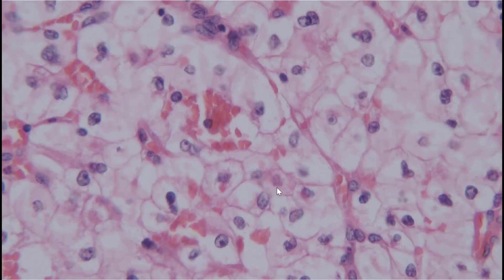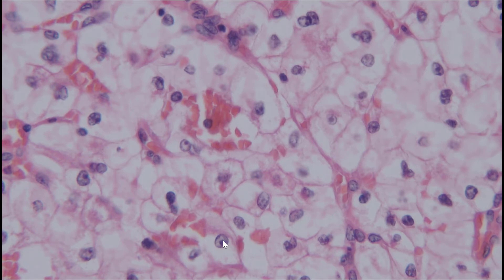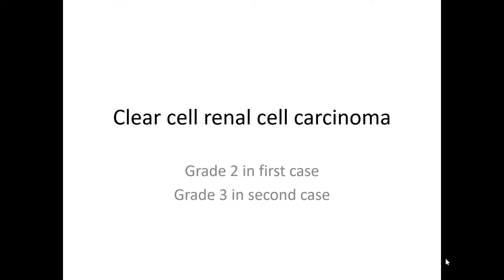On the 40x objective, compared to the previous case, there is more pleomorphism, multinucleation, variation in nuclear size, and nuclear membrane irregularities. Most importantly, much more conspicuous nucleoli are clearly visible. This is a clear cell renal cell carcinoma, nuclear grade 3. So the final diagnoses are clear cell renal cell carcinoma, grade 2 in case 1 and grade 3 in case 2.